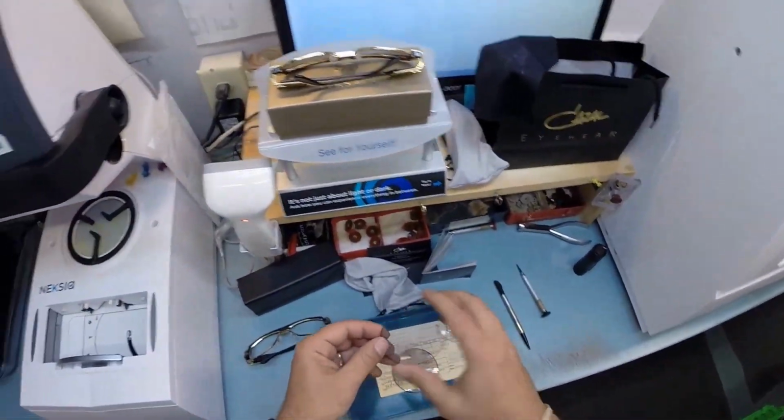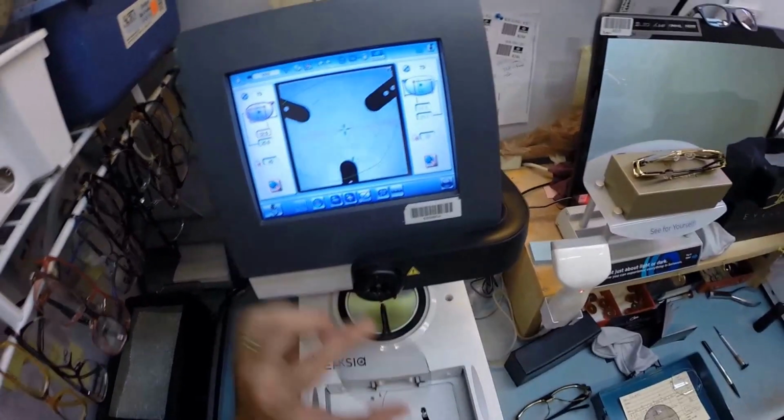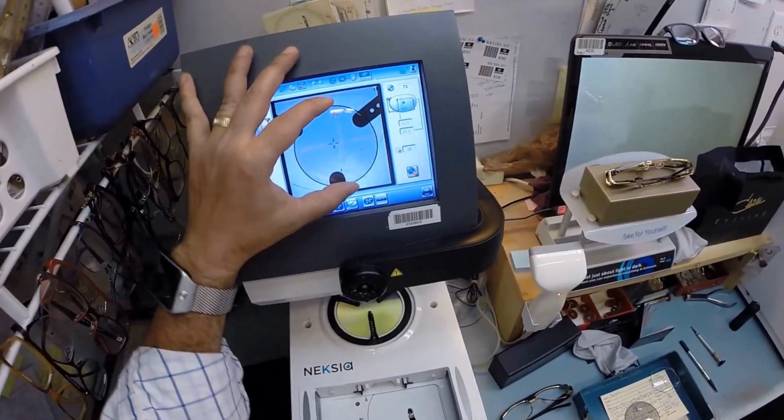I went ahead and had these done in advance. The reason I put those dots on there is that it tells me how the lenses are oriented, and they're just right. So I'm going to put that down on the platform.